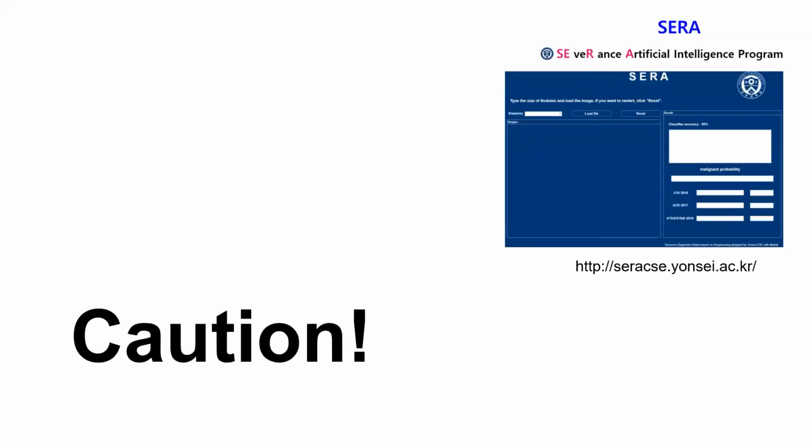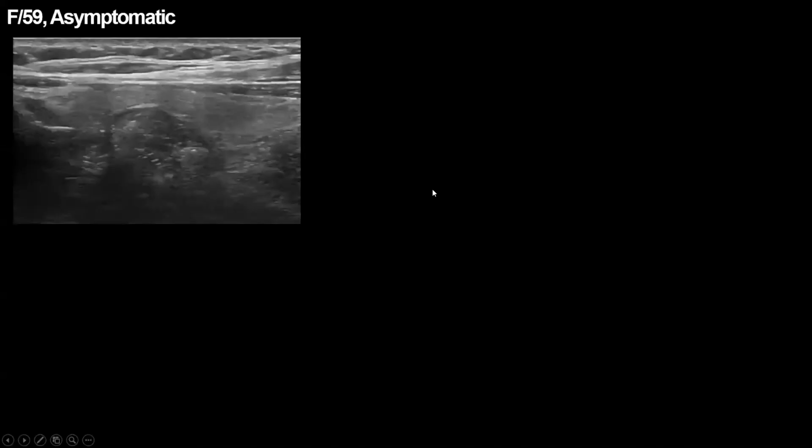As I stated earlier, CAD can help the diagnostic performance of inexperienced physicians. Now, what things do we have to keep in mind when providing CAD assistance to inexperienced physicians? Here are a few examples. This 59-year-old woman had an asymptomatic thyroid nodule incidentally discovered.